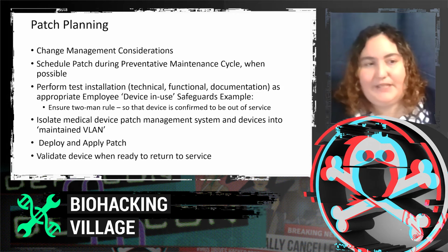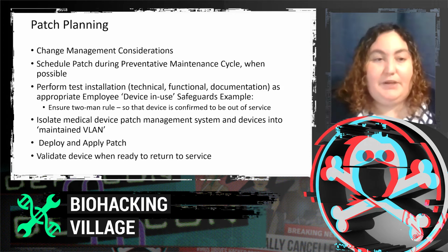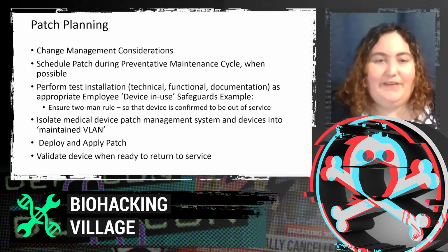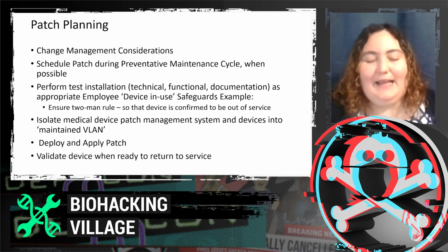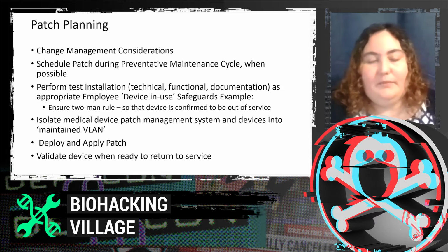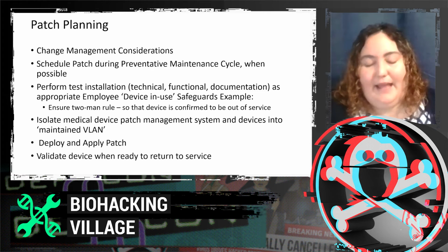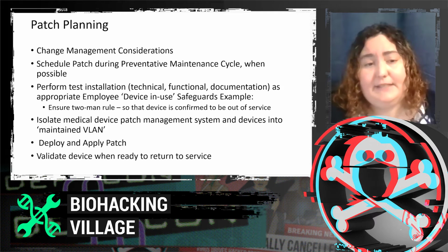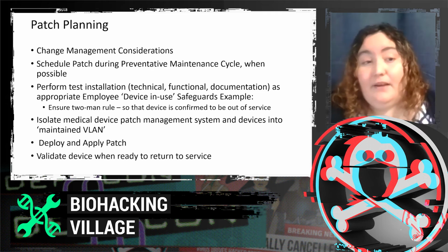Here are some considerations. You're going to want to see what your change management policy says. Schedule the patch during the preventive maintenance cycle. I can't stress that enough. Please do not use a device that's in use. Should any accident happen, you don't want to take a device offline that a patient is using.